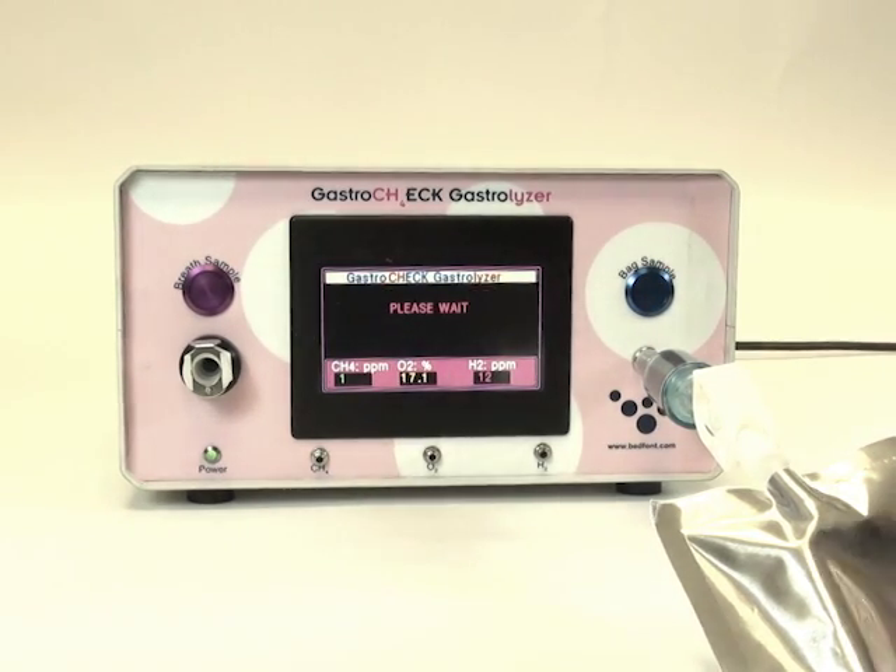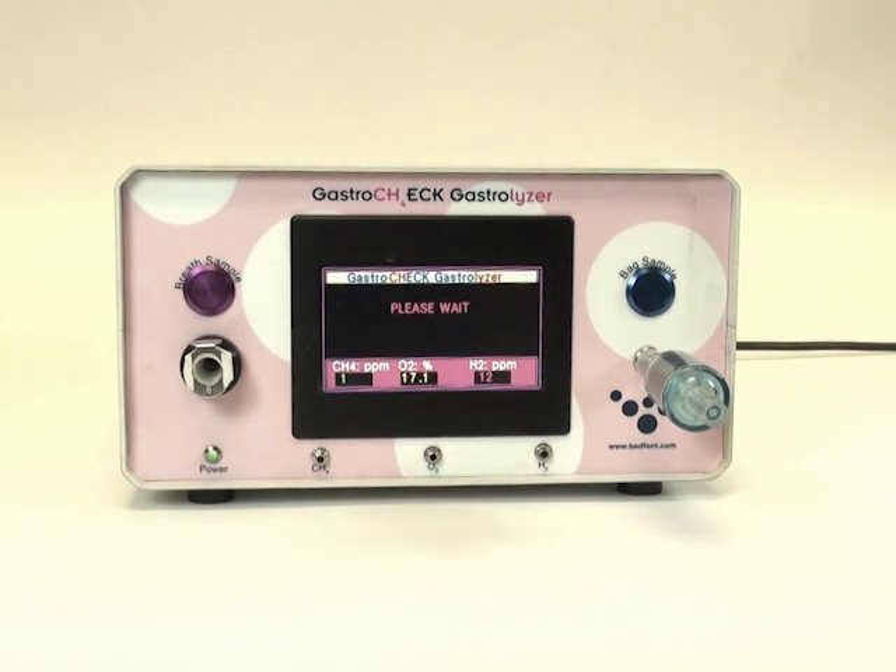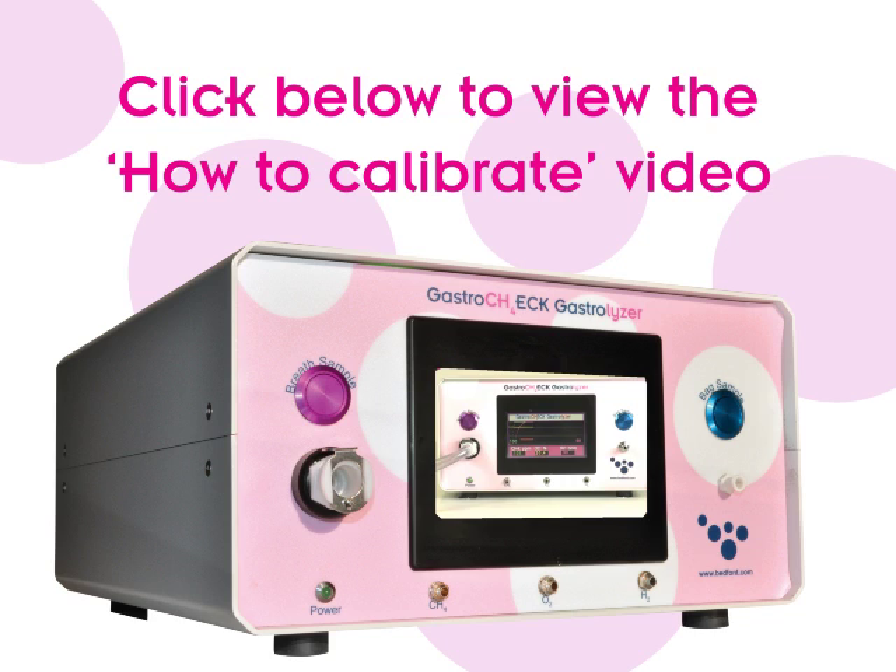Please note that the breath sample bag should be removed either before or immediately after the bag sample button has been pressed. To visit the calibration video, please click here.